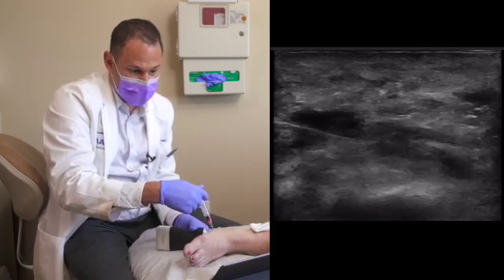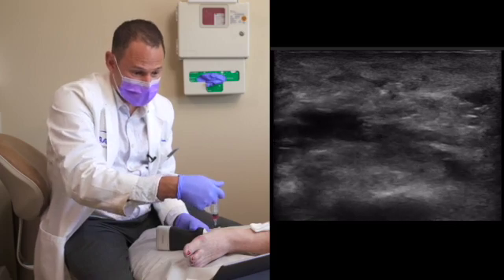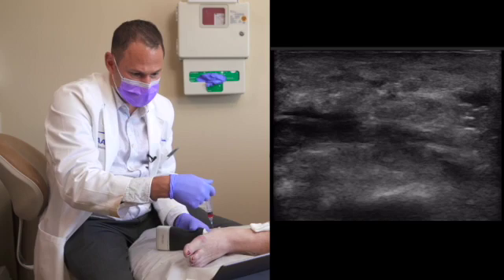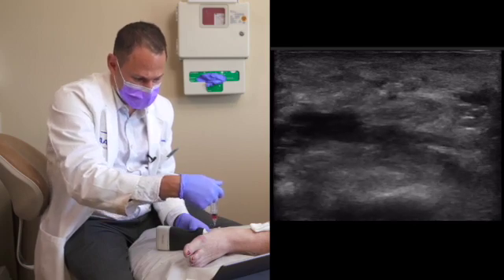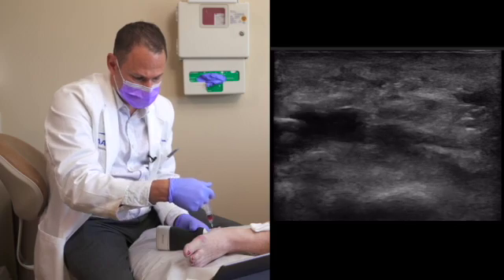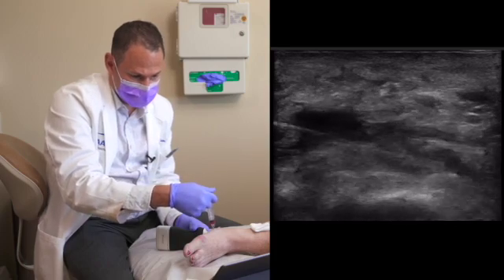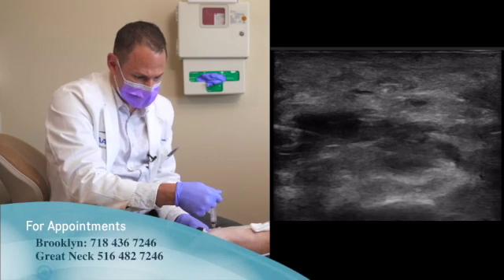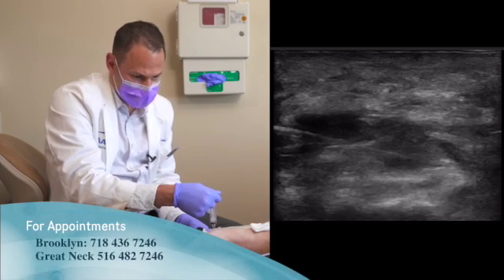This patient underwent a tibial nerve block prior to the PRP injection. The PRP was injected into the plantar fascia, which can be a painful shot. The tibial nerve block alleviated the pain of the injection. The PRP is now on the plantar fascia — it may take a few days to weeks to work, but will hopefully give her pain relief superior to that of steroids.